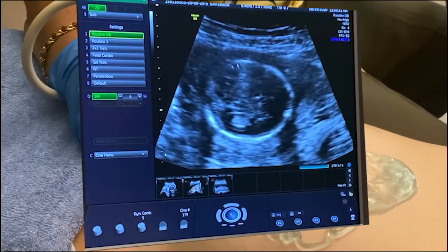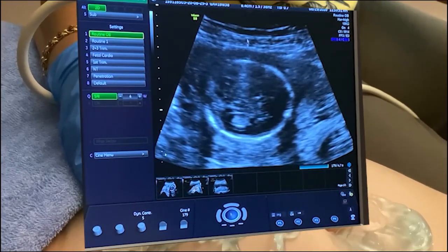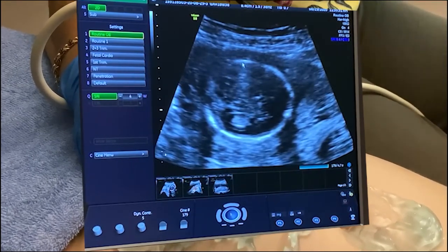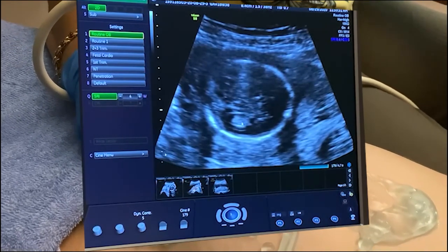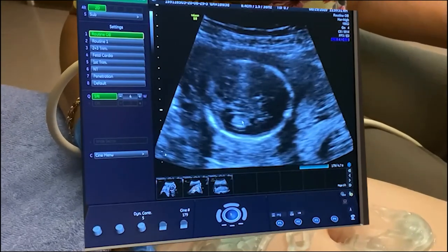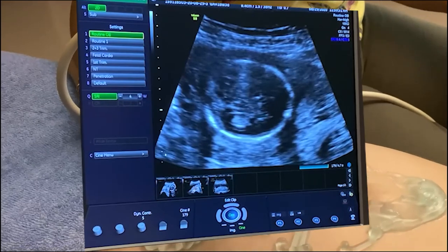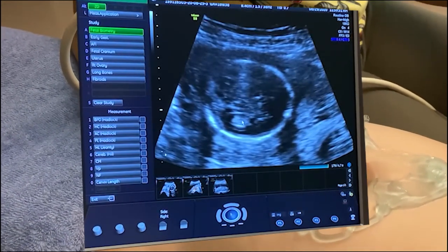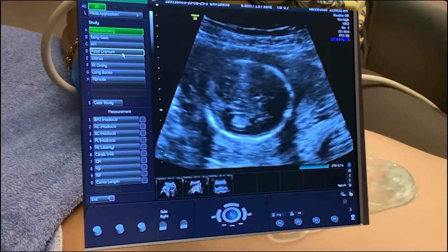As it hits a strong reflector like the fetal skull in this anterior portion, it's going to bounce back and forth between the transducer and the hard part that it hits. And so it makes us able to see the downside, or the ventricle most posterior, clearer. So this is what we're going to measure. I'm going to hit the calculation button because I want this measurement to go into the fetal package. I'm going to select fetal cranium.